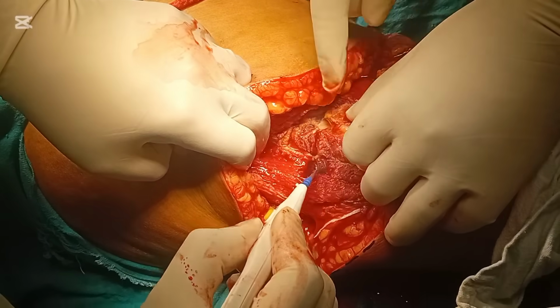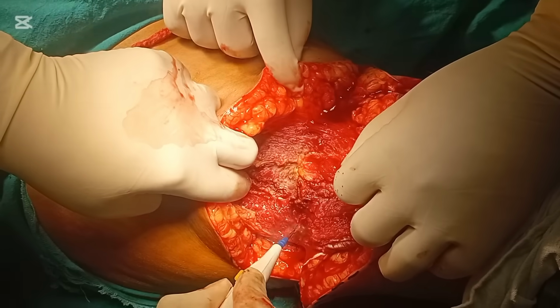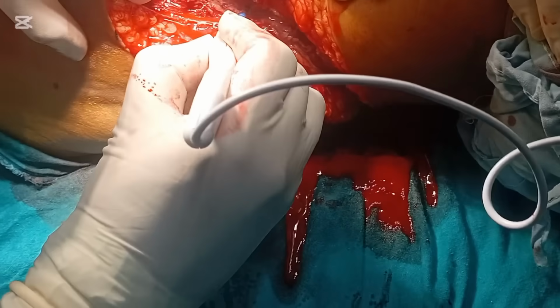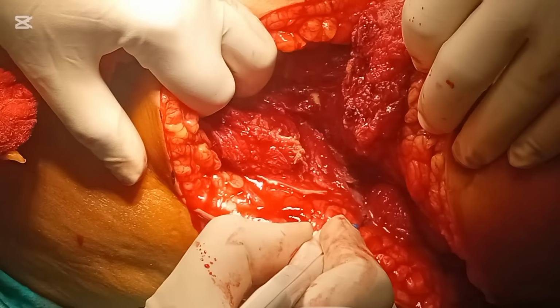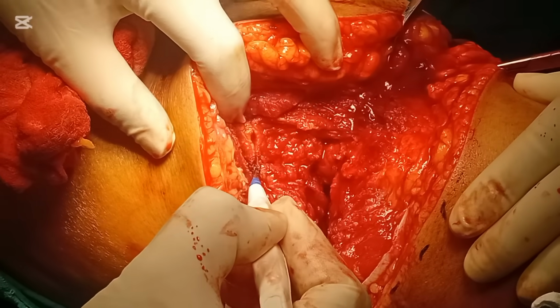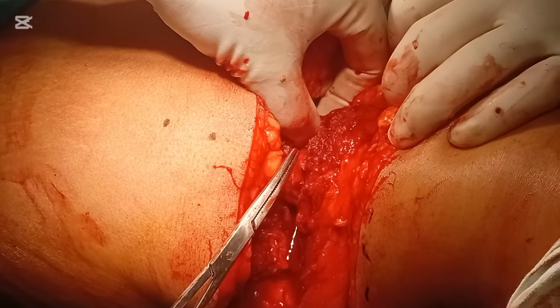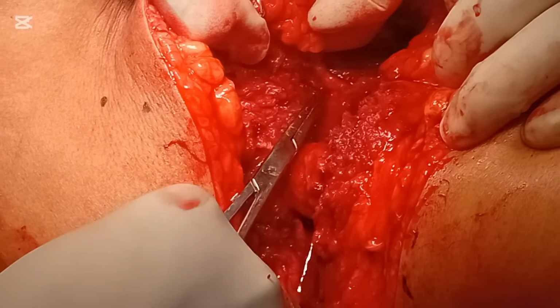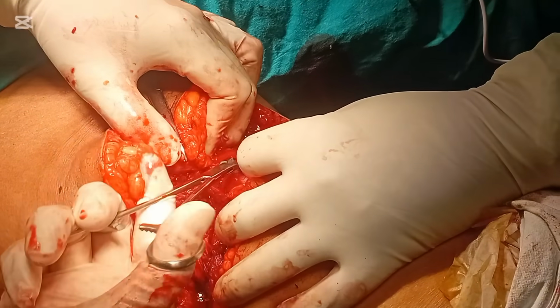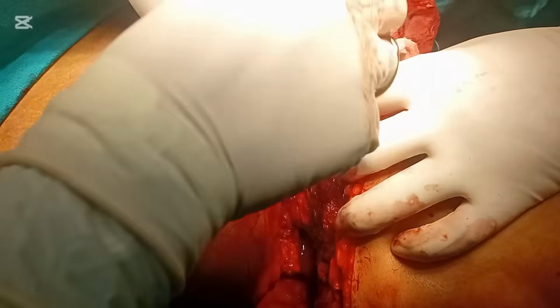Now we are going deeper down till the femur bone. Hemostasis is an art, as it will clear your operating field. Make sure of it by ligating the vessels or coagulating with cautery. Here you can see we are now on the medial side of the femur bone containing the neurovascular bundle. The neurovascular bundle is located in the adductor canal. Now we have separated the adductor canal from the neurovascular bundle.